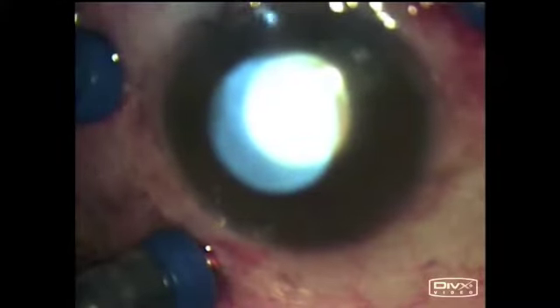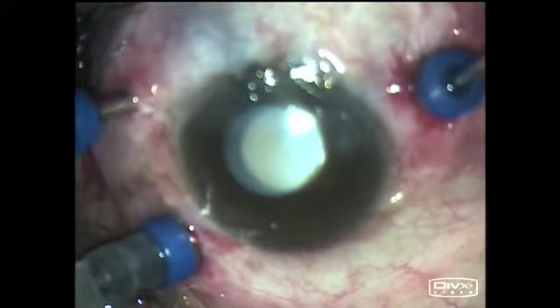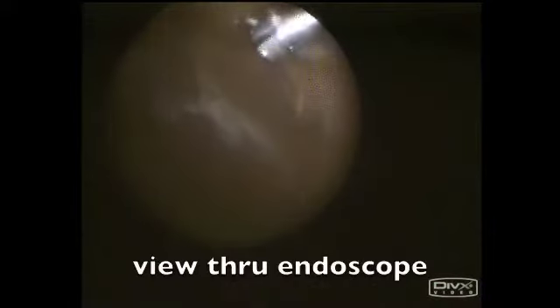First, phacoemulsification was performed in an attempt to visualize the foreign body through the conventional microscopic view during vitreous surgery, but this was not possible. So then the endoscope was inserted, and this is the view through the endoscope.